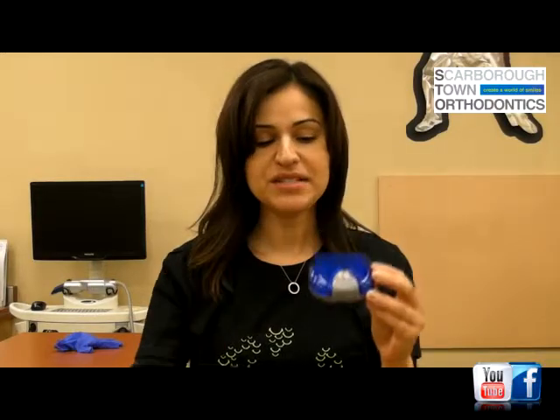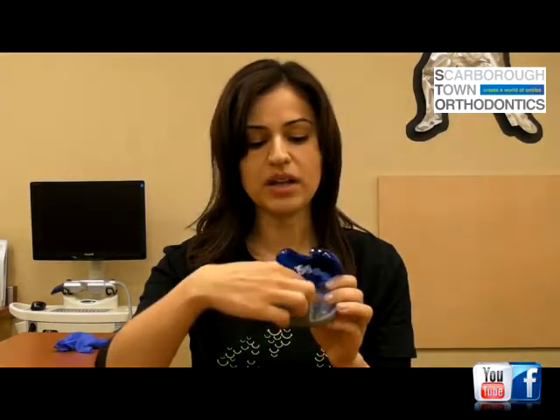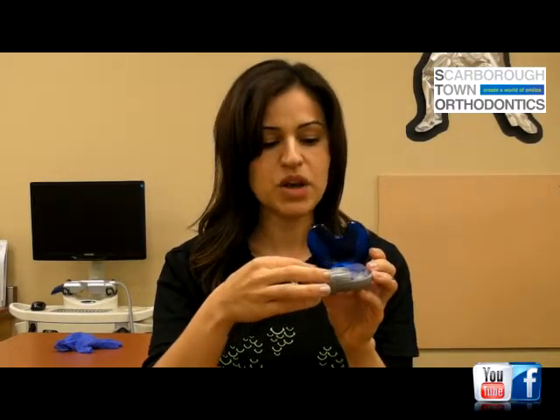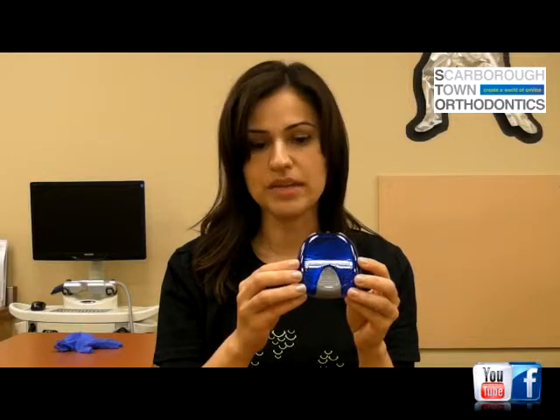So we will be providing you today with 2 cases for your aligners. And inside there is enough room for you to fit both of the aligners as well as a chewy. And that way you can keep one with you at all times. The most common problem we see is that when you take out the aligners to have a meal, you end up wrapping them in a tissue or a Kleenex and somehow they get thrown in the garbage. So if you have a case with you at all times, this gives you a place to keep your aligners, less chance of you losing them.